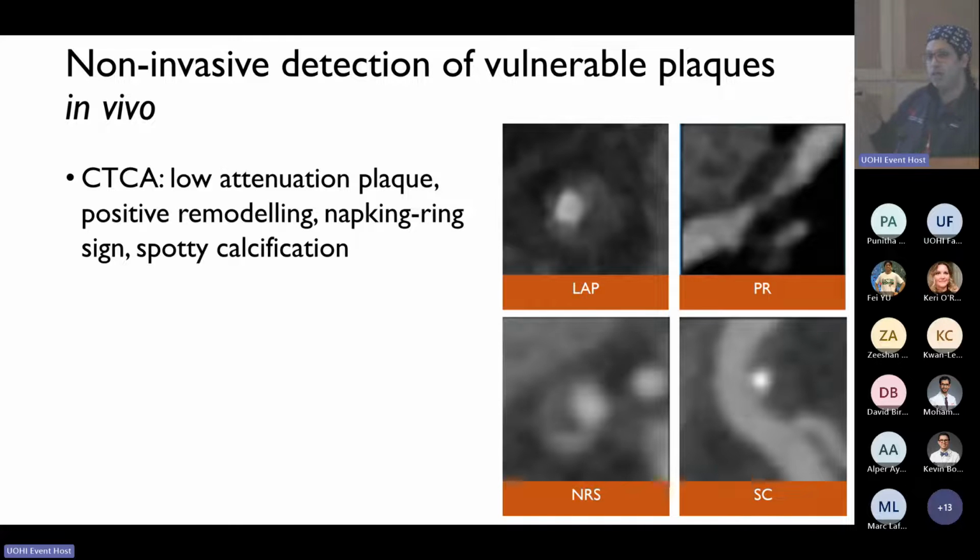And this is where non-invasive imaging is fundamentally limited just at this time point, but the resolution is improving basically year on year. And we are going to get to probably a state where these things aren't quite so blurry and the accuracy and precision of detection improves with CT. We're not quite there just yet, but we're working on this right now.